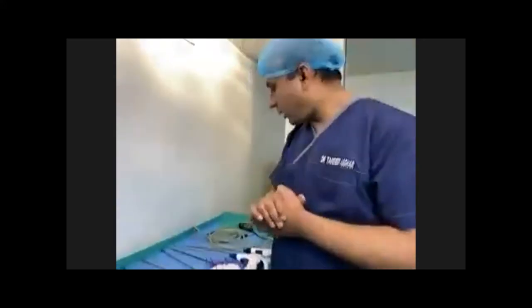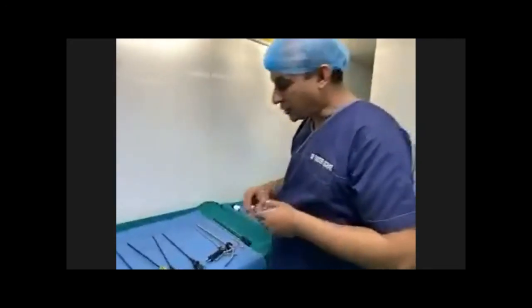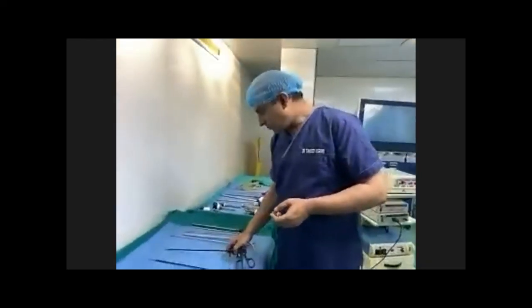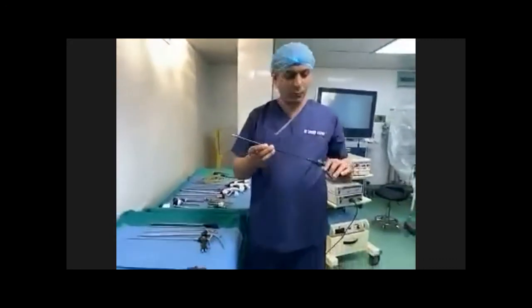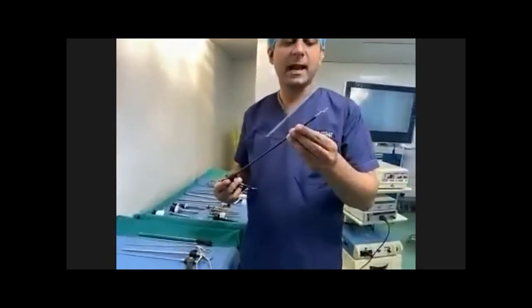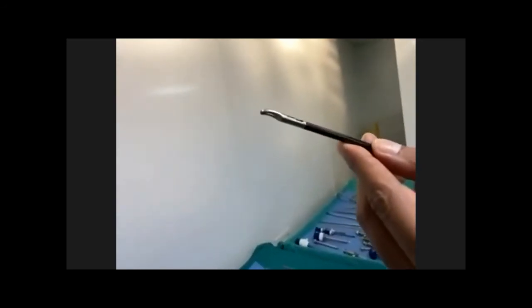Now coming on to the other laparoscopic instruments which we usually use in basic laparoscopy. As most of us know, because all of us are surgeons, this is an important instrument. What is this instrument called? It is called an endodissector. You can see the tip of it. It is just like an artery forceps, angulated in front. It is also called Maryland, right?